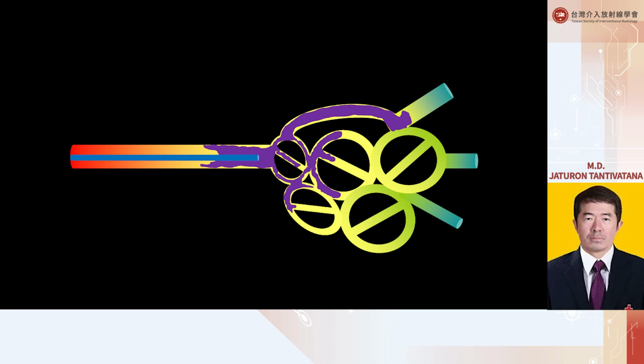For example, like this one, we don't want the Onyx to migrate into the venous component too much, so we have to wait a little bit until the DMSO disperses out and this becomes more solid, and then pause, and inject the same with the inside compartment again. Just wait a little bit, letting this one disperse out and become a little more solid, and then we inject again. So it will come down into the smaller portion like this one, and repeat the whole process.